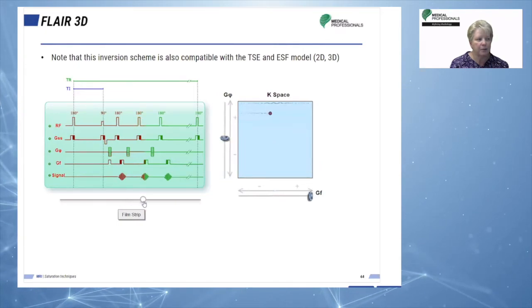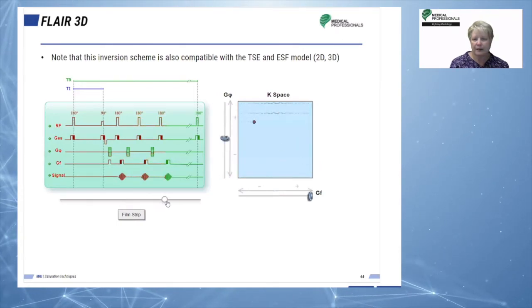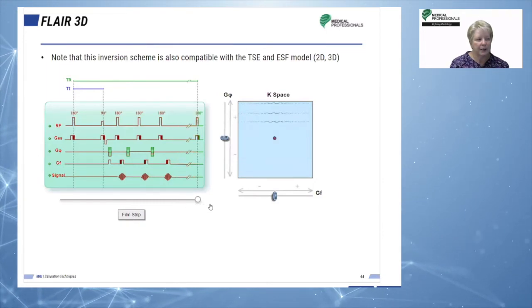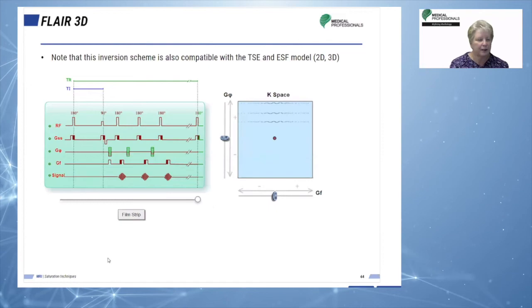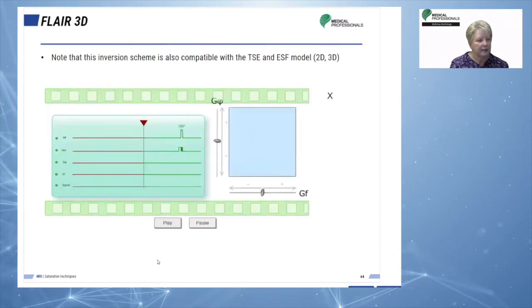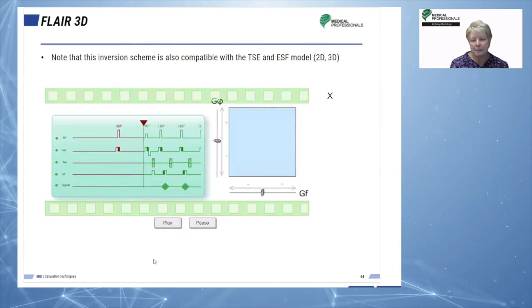Okay, so as I move the bar across, we're able to see that. Okay, now we're going into another excitation. Okay, let me click on the film strip, and we'll look at that as a complete set.